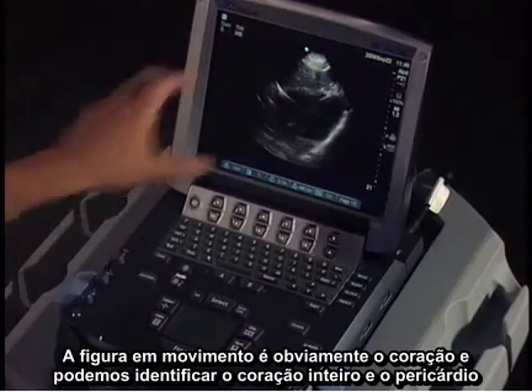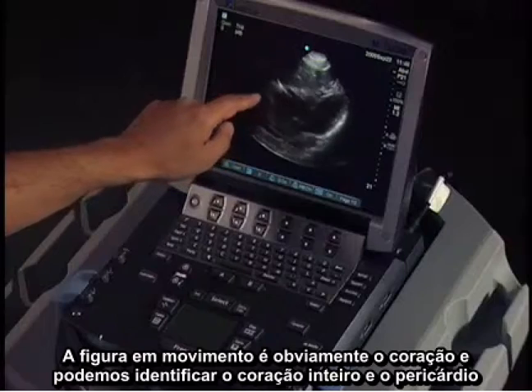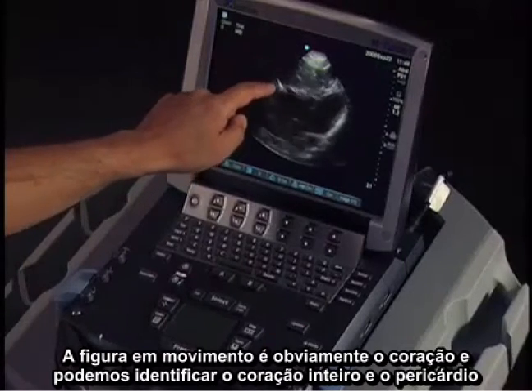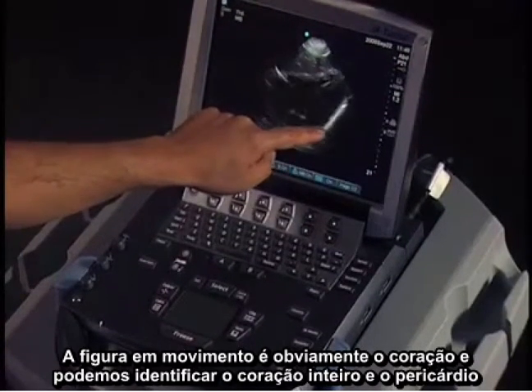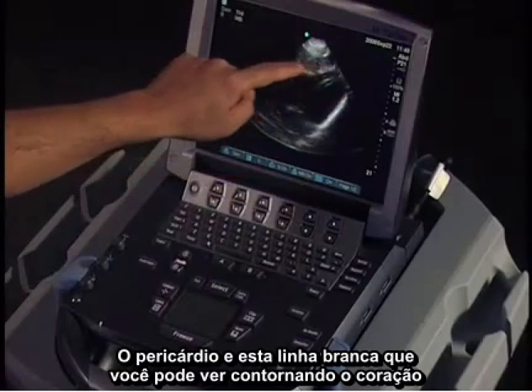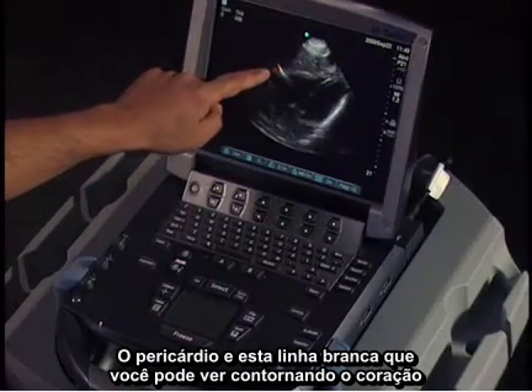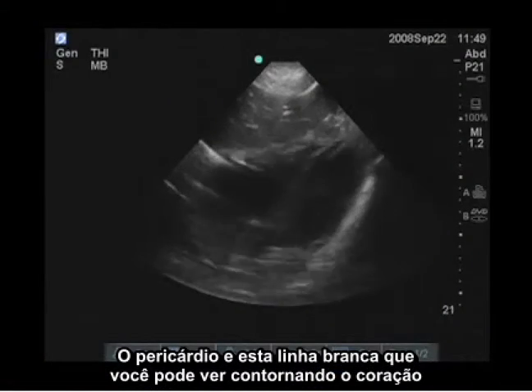The beating thing in the center is obviously the heart, and we can identify the entire heart and the perimeter of the heart with the pericardium. The pericardium is a white line that I'm seeing, and you can see it surrounding the full heart.